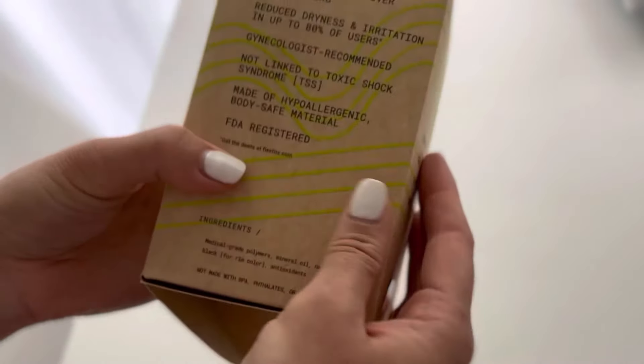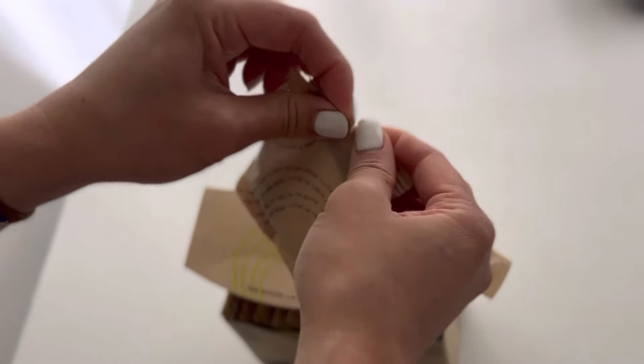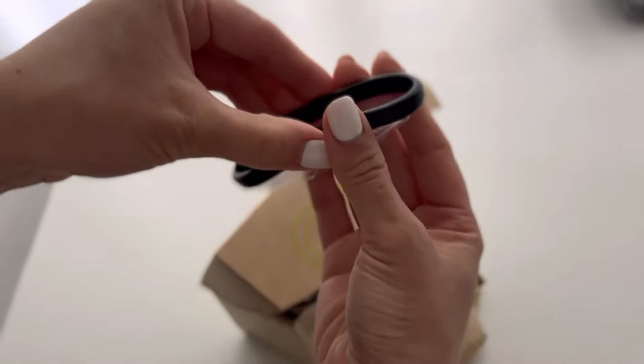It's supposed to hold up to 30 ml of blood. This is a disposable one — there is a non-disposable one, but I went for the disposable one because I feel like that's a little bit more hygienic, and also I'm usually on the go. This is supposed to help reduce cramps in over 60% of users, also reduce dryness and irritation. It is gynecologist recommended, not linked to toxic shock syndrome, hypoallergenic, body safe, and FDA approved.